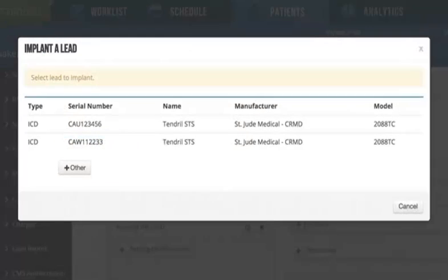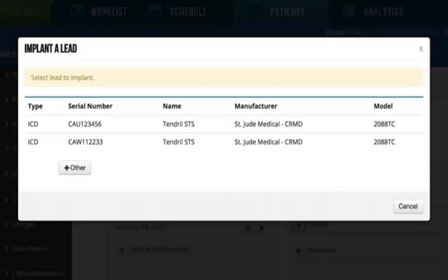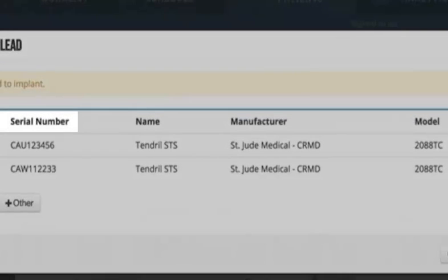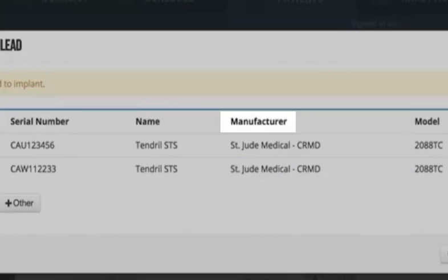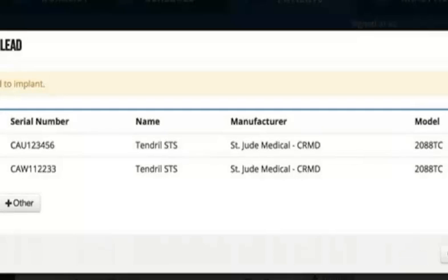Next, click the plus button in front of lead implant and you get a modal with each lead listed with the serial number, model name, manufacturer, and model number.